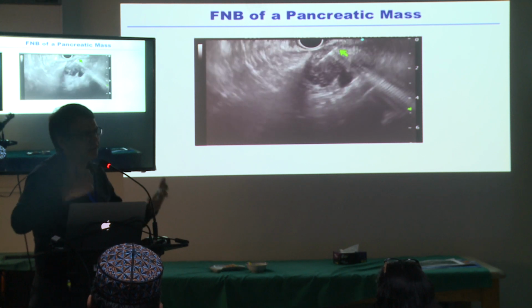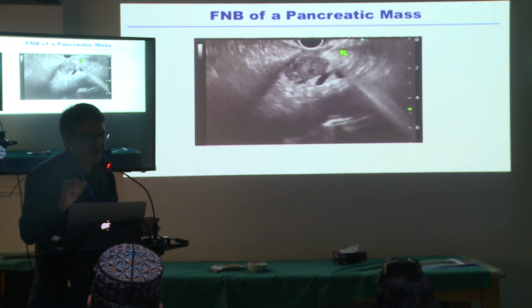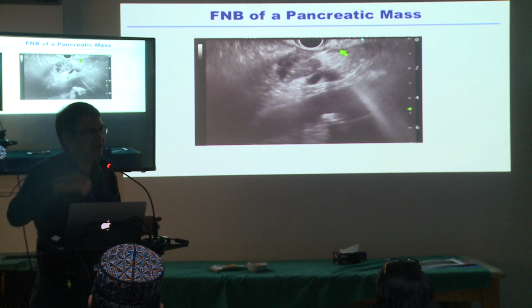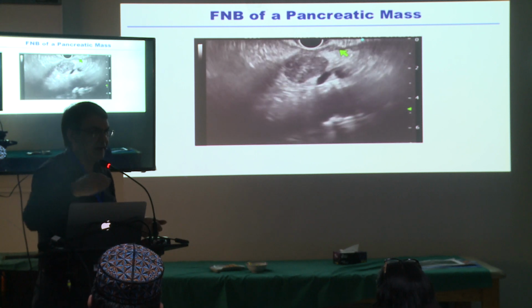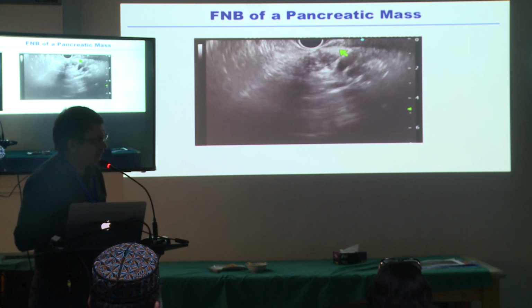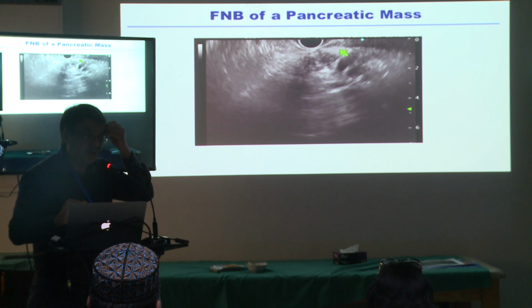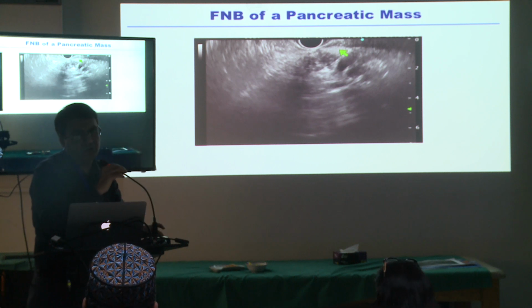It's not an FNA needle. That's what I'm trying to really say. It's totally different. And with this one, as soon as I puncture, you see that it's not a quick movement. I do a slow movement and let the tissue go into the needle. I don't know what your practice is, but for me, it has always generated a good specimen.